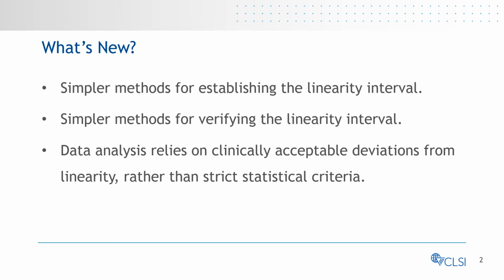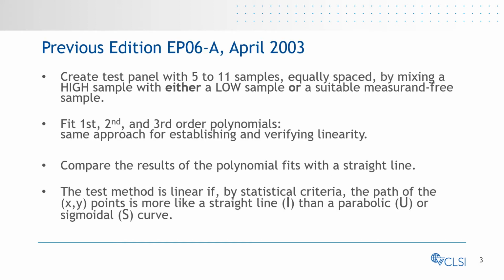The new version of EP06 includes simpler methods for both establishing and verifying the linearity interval for a measurement procedure. It also includes simpler statistical methods and relies upon looking at clinically acceptable deviations from linearity rather than strict statistical criteria and limits.